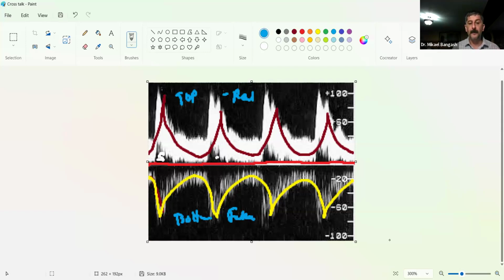On a spectral Doppler, it's not that straightforward. But the question then is, what is it that you see? You see both a positive Doppler shift and a true copy of that positive Doppler shift represented as a negative Doppler shift. So which of these two here is real and which is the fake one?